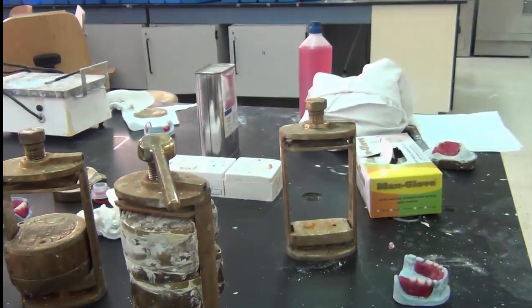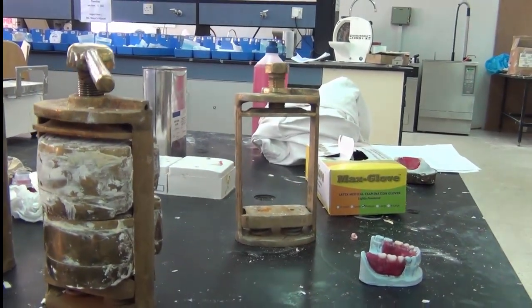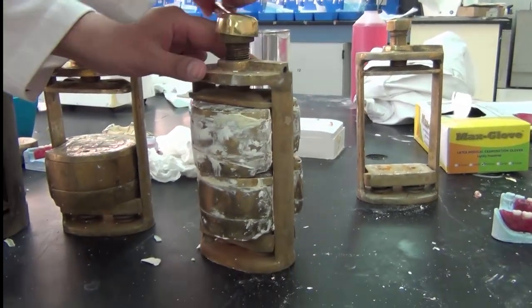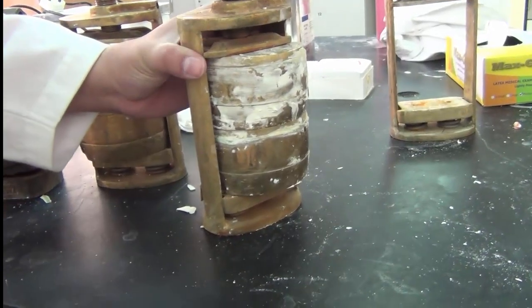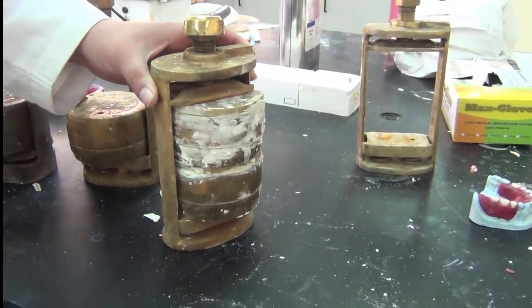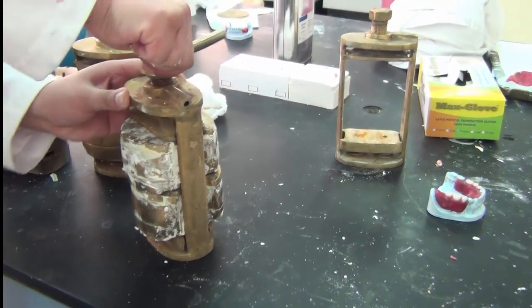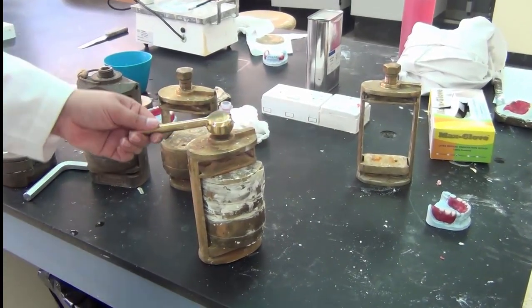So now, after removing from the hydraulic press, we place the 2 flasks in the metal frame or the clamp, and we begin manually rotating the upper member into place. Notice that this is going down and it's pressing down, and this maintains the pressure on the 2 flasks while the curing is happening. We keep rotating it manually until we get no movement of the clamp. Okay, and this is ready.